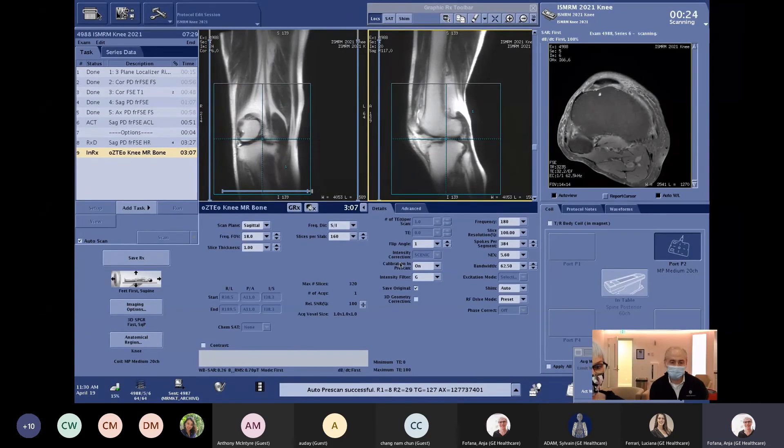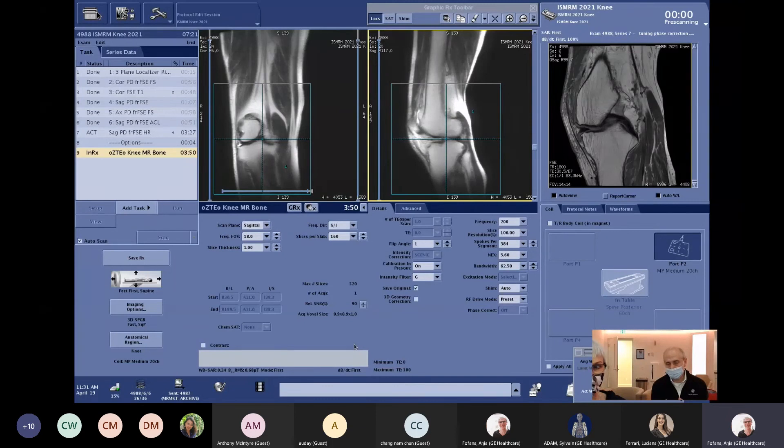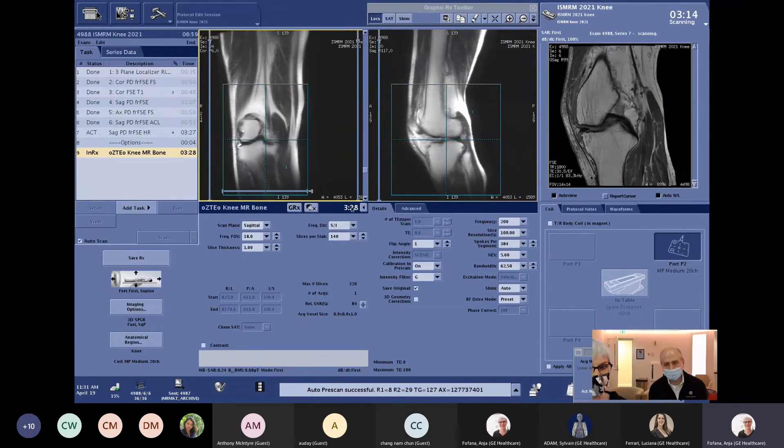We have some other parameters that can be changed based on the anatomy being scanned. We're doing a 1 mm slice thickness with 1 by 1 resolution. You could scan at slightly higher resolution — changing the frequency encoding from 180 to around 200 might give you 0.9 mm — but that would reduce coverage, so you might need to increase the number of locations. Scan times are pretty good, around three minutes or so. Maybe reducing to 140 locations covers it well — about 3 minutes 28 seconds.